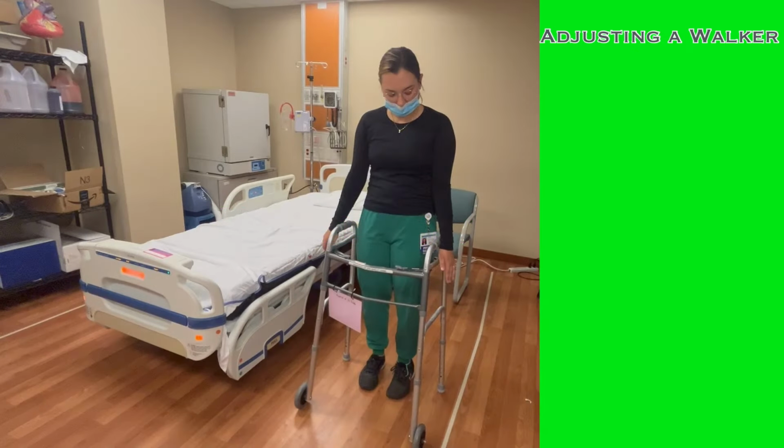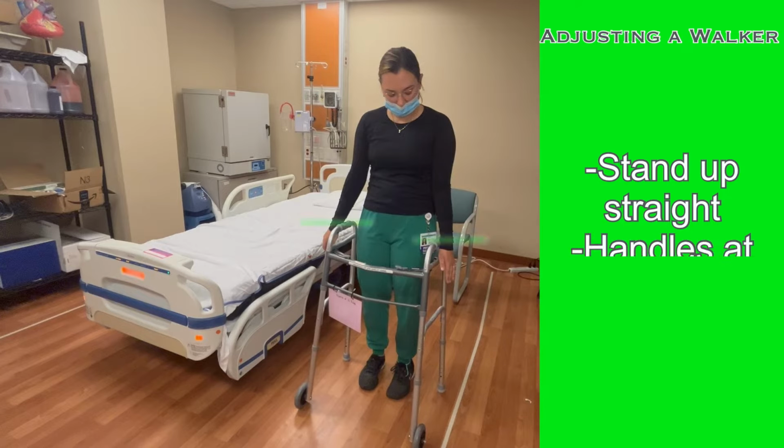When utilizing a walker to support a patient while standing or ambulating, making sure the device is properly fitted to the patient is extremely important. The optimal height of a walker can be measured by helping the patient stand up straight and raising or lowering the walker handle height until it is at the same level as the patient's wrists.